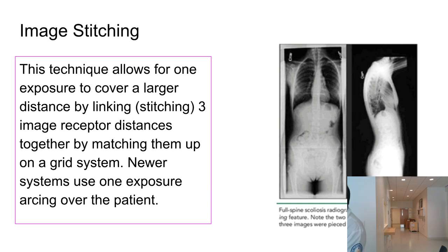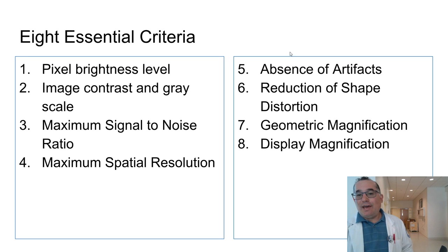They have some really sophisticated equipment now where the tube moves down and somehow accounts for the central ray not always being in the same place to help reduce the distortion that we've talked about all of last year. HSS has two sets of tubes that go down the patient 90 degrees apart from each other and get AP and lateral at the same time. Pretty nifty.